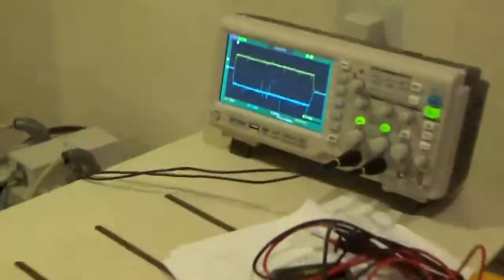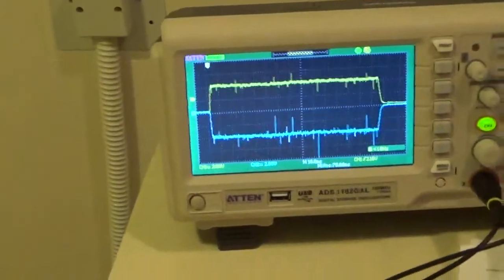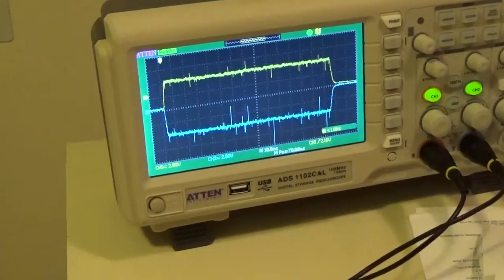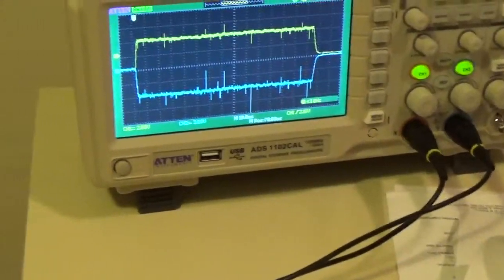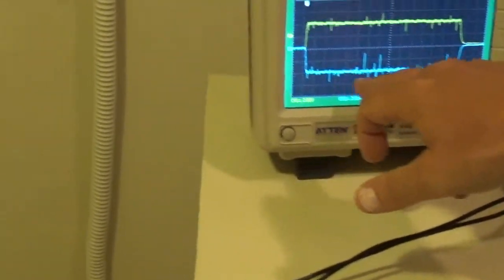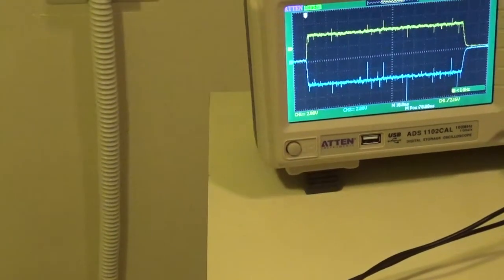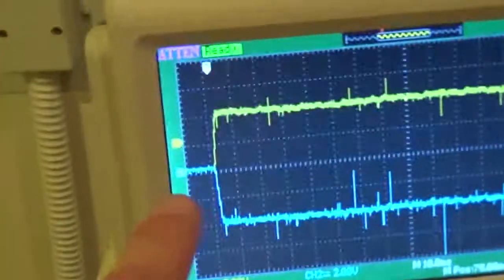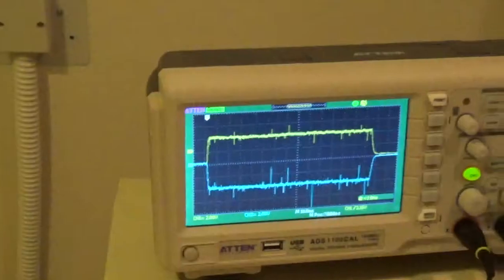That was a good one. All right. What do we have? Now, as you see, that's our butterflied waveform. It looks to me like this could drop lower than this. It's just a hair. Is it or not? Not really. If you look, I centered this a little tiny bit above. That's how you really got to watch your centering and so forth.